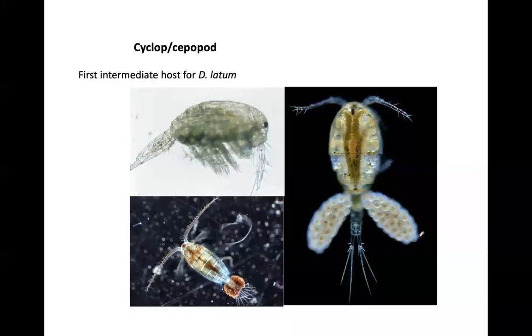These copepods could be different types, but they're mainly also known as cyclops or copepods, a type of crustacean. They have typical features; you will see the cyclops because they have one eye or eye-like shape, and the others are tick-like in shape, but all these are crustaceans. So this is an image of a copepod, which is an important intermediate host for Diphyllobothrium latum.